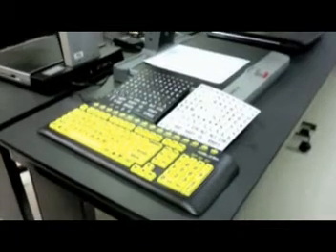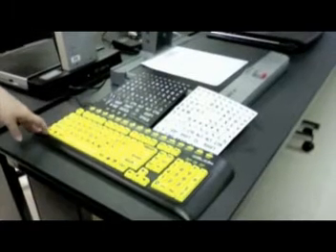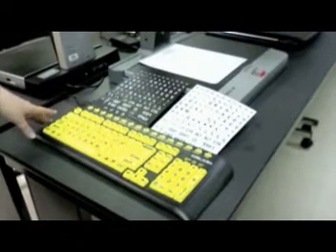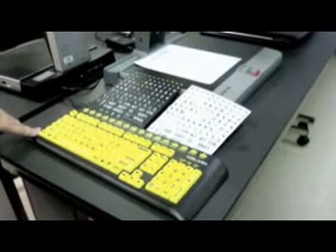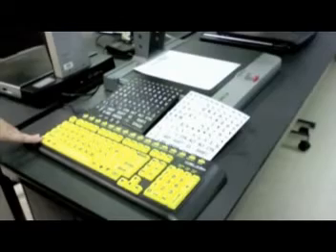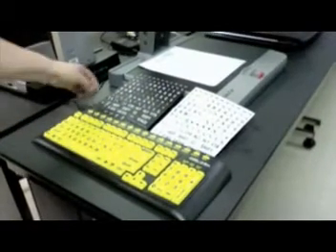Especially during the learning process, people may need to use a modified keyboard in some manner. The modification may be something like making it high contrast with larger letters. What I have here is a yellow background with black letters.